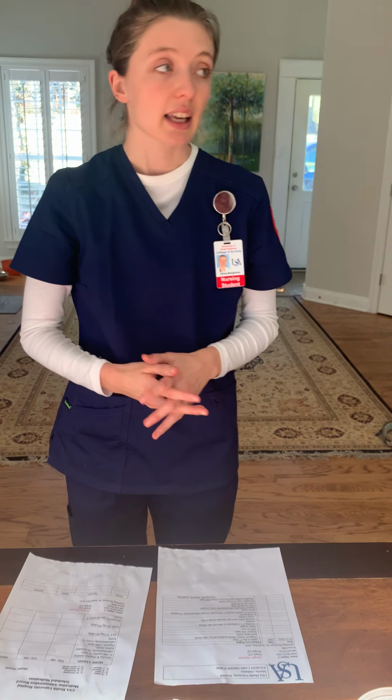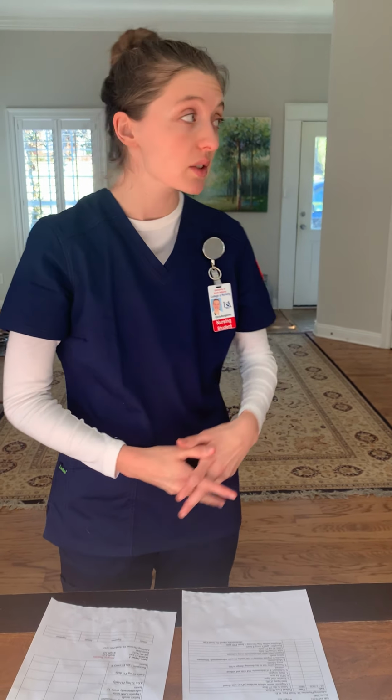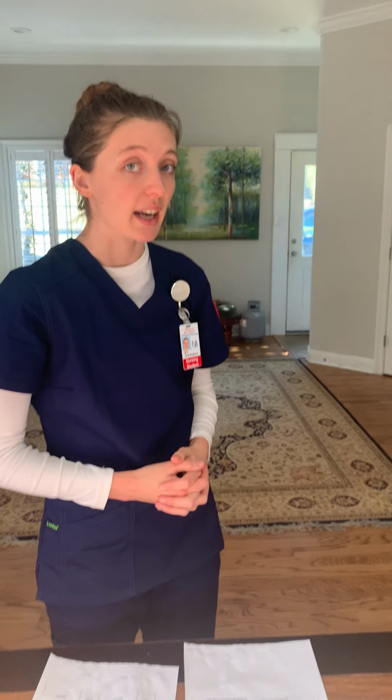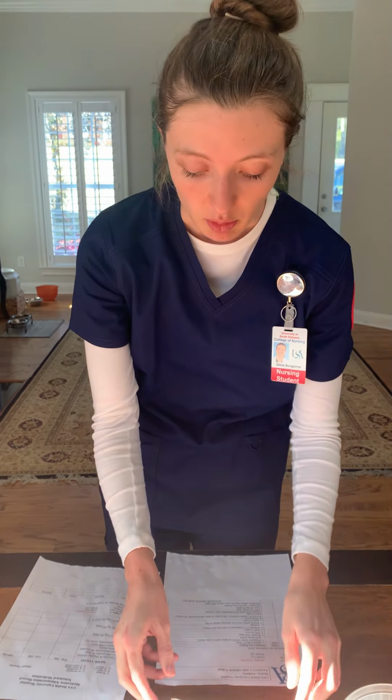And then the patient receives heparin dose every 12 hours, so I look to see that it has in fact been 12 hours, and it has. This is a subcutaneous route, and I will be using this needle and syringe.